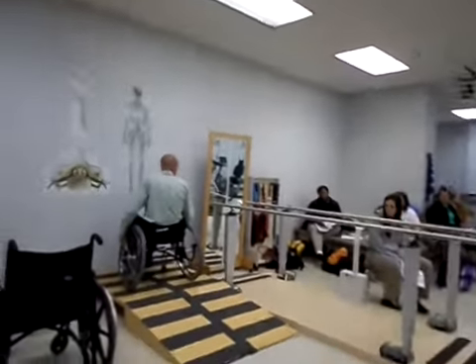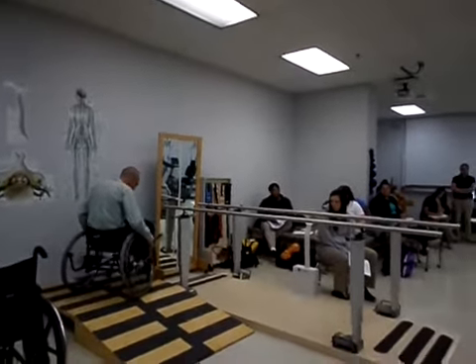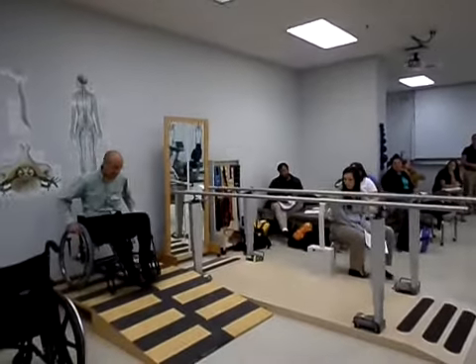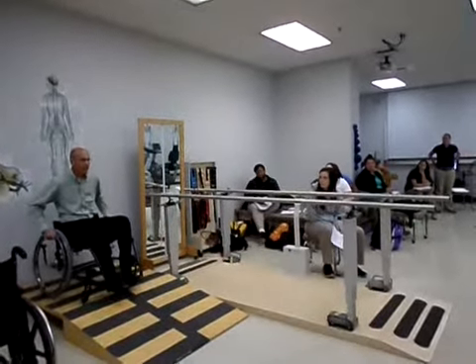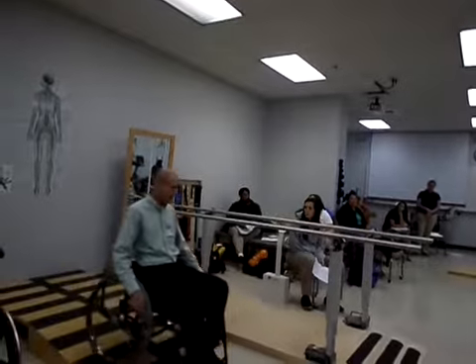And then should I go down frontwards or backwards if I'm in the chair by myself? Front. Yeah, front, forwards. Now be very careful turning around up here too. It's very difficult, not much room to turn. So be careful with that. So when you're going down, you have to lean which way? Backwards. You lean more backwards to get your center of gravity back further. Use your hands as a brake to let yourself down gently.